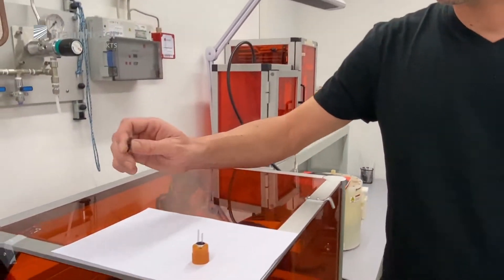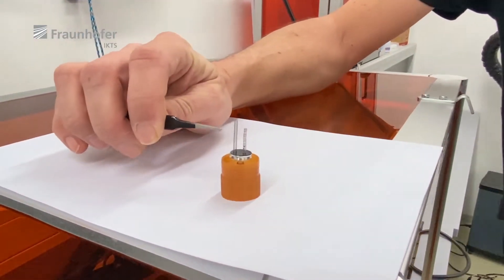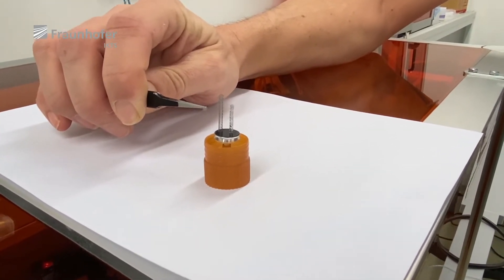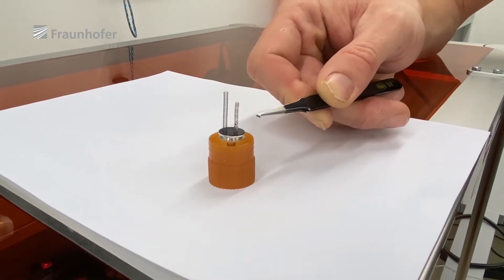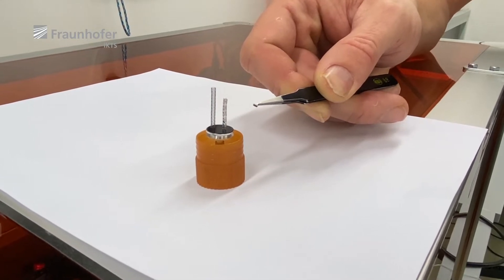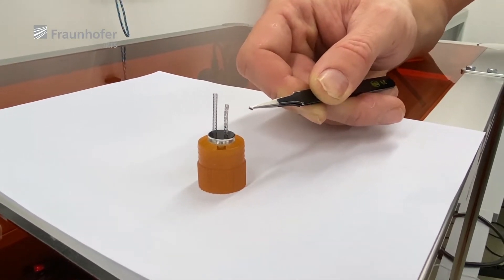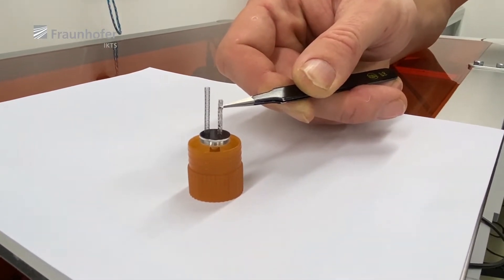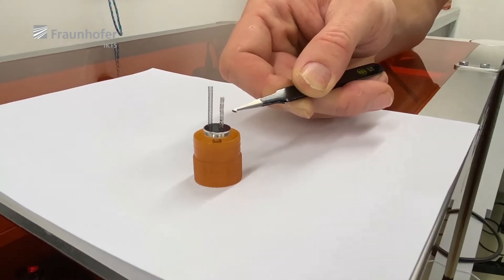Good afternoon ladies and gentlemen. My name is Martin Kuttner and today I want to give you a small tour of our lab where we test the quality of cardiovascular stents. We have two stents under test: the big one is a permanent type which should not dissolve, and the small one is a degradable type which should dissolve after some amount of time. We test the first one for stability against corrosion and the second one for how well it degrades.